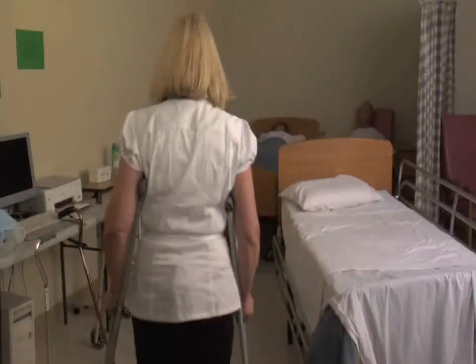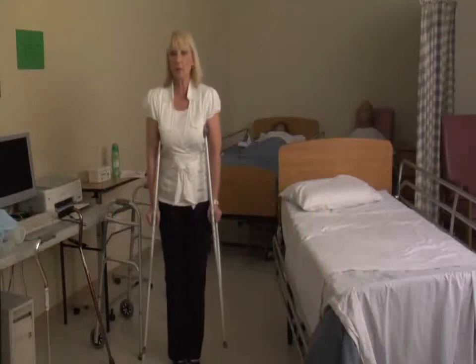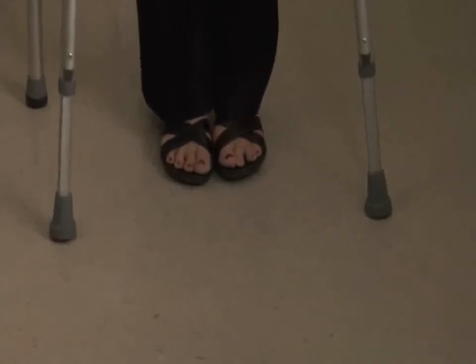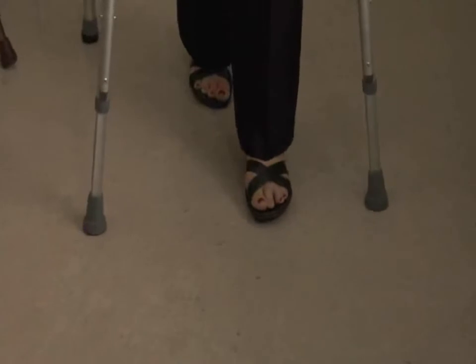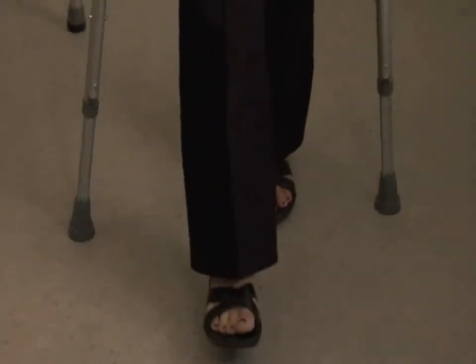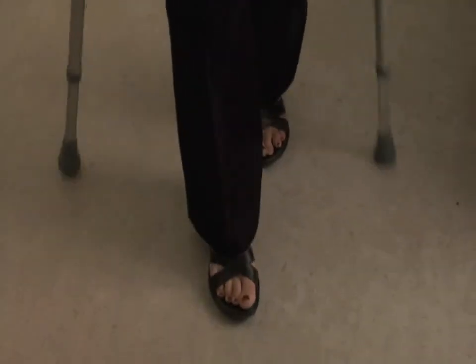This is hard, using crutches, I have to tell you. It is. Okay. So now our patient is starting to get better, and the doctor's ordered that our patient can have partial weight bearing. So the crutches go forward first, and then the weak leg or injured leg, and then the patient can use the crutches to take weight off that foot, and then they'll just step through. So crutches, weak leg, and then the strong leg. Always weight on the hands.